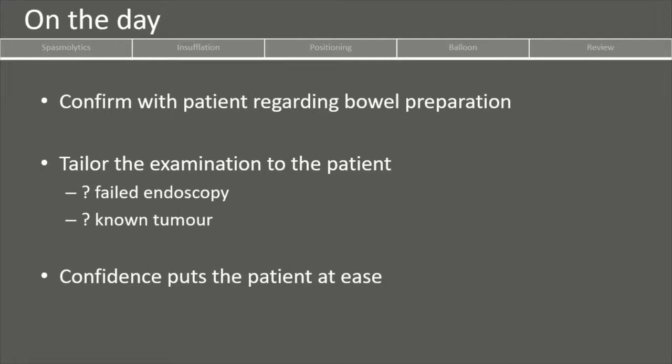Did they take it all? Does it sound like it's worked? And then this is your opportunity, if you're performing the study, to tailor the examination to the patient.